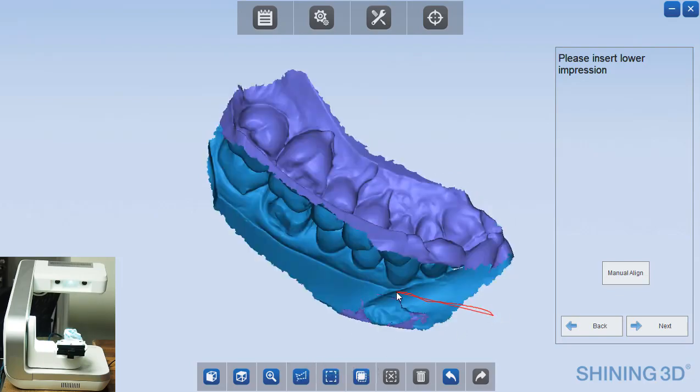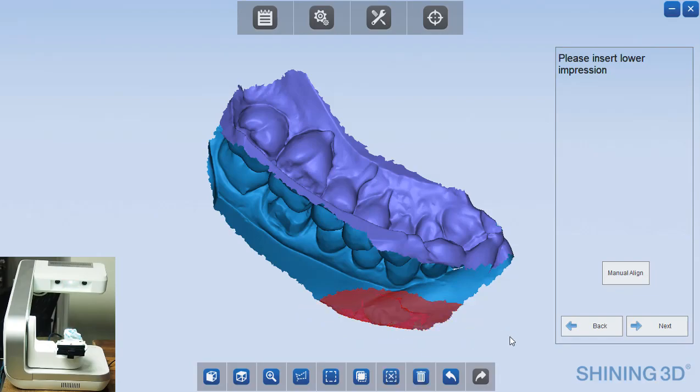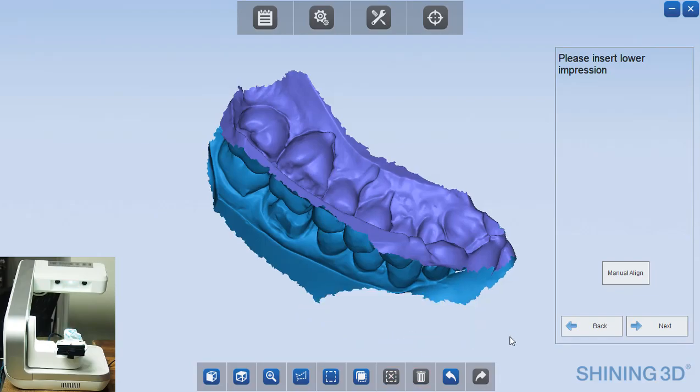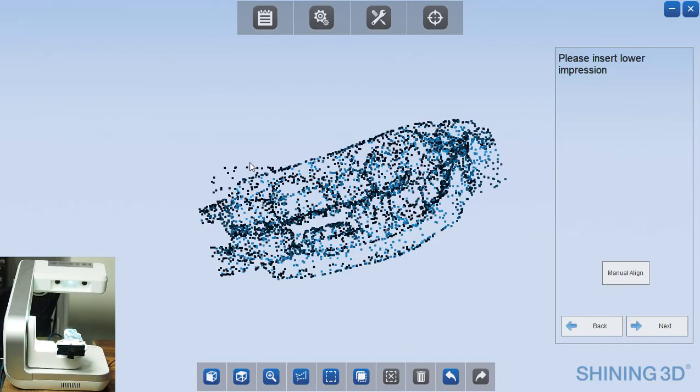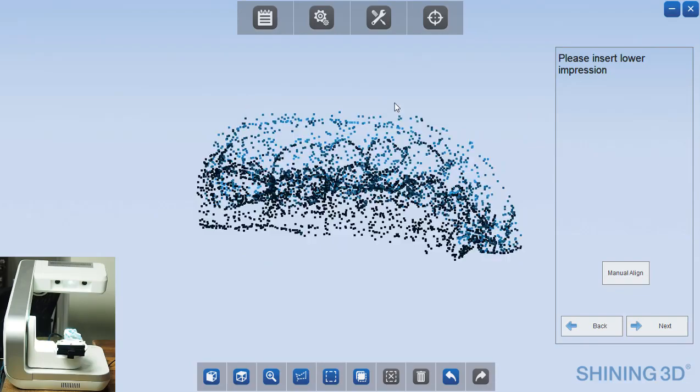And so here you can see the end result. These are our two STL models of the upper and the lower. And once you click next again, that will complete the scanning process.